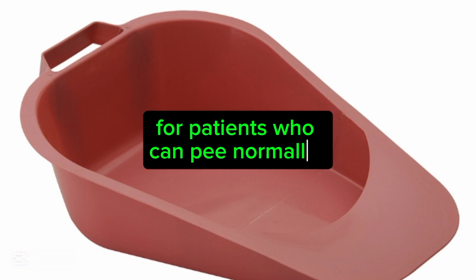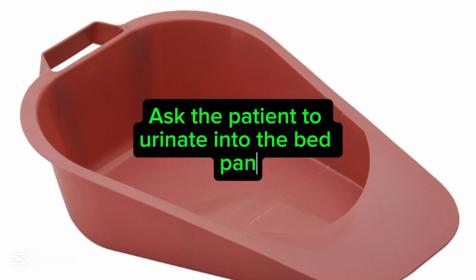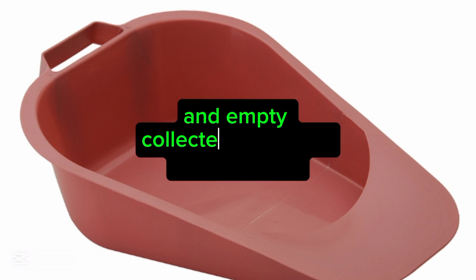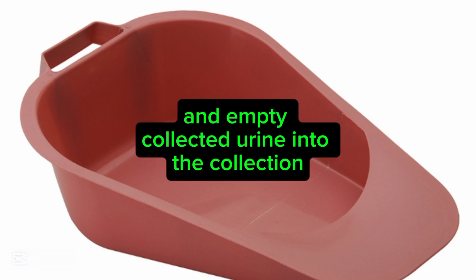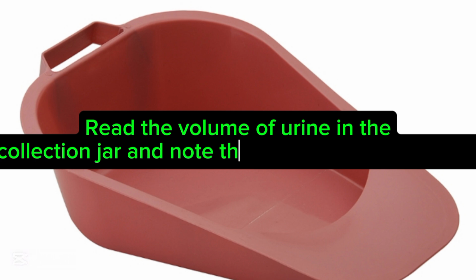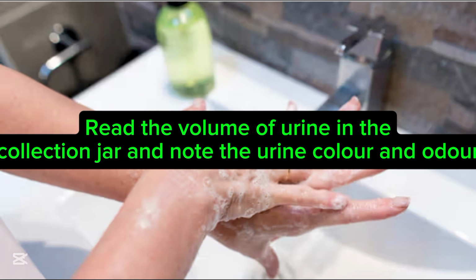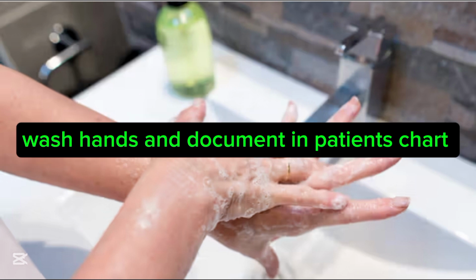For patients who can pee normally, ask the patient to urinate into the bedpan and empty the collected urine into the collection jar. Read the volume of urine in the collection jar and note the urine color and odor. Wash hands and document in the patient's chart.